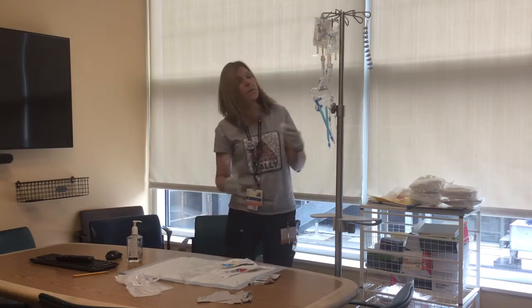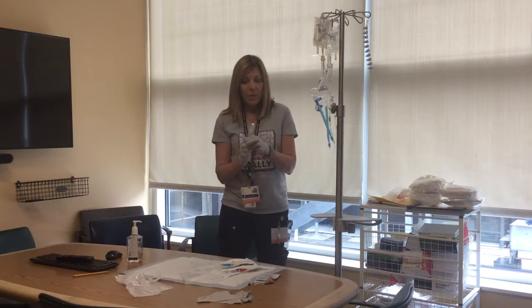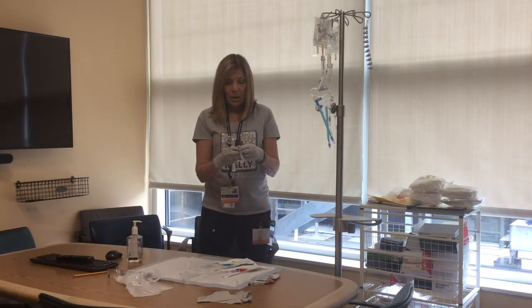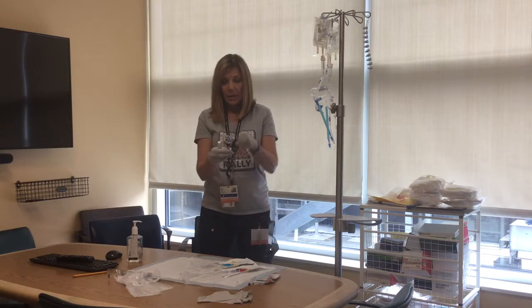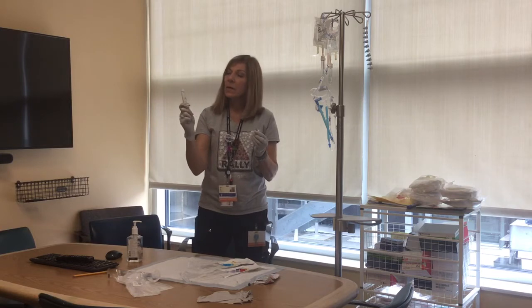So that you don't have to touch this multiple times, prime the medline cap first. You're just opening this up, maintaining the sterility of the needleless connector inside the package, the same as you would for doing a cap change.